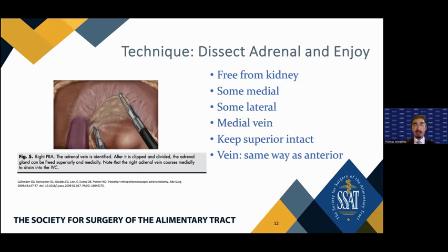You find the vein just like you would on the anterior approach, whichever clip you would like to do, and enjoy the dissection surrounding.